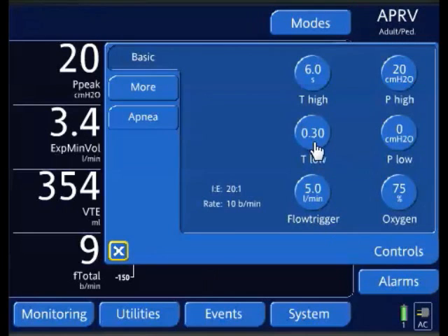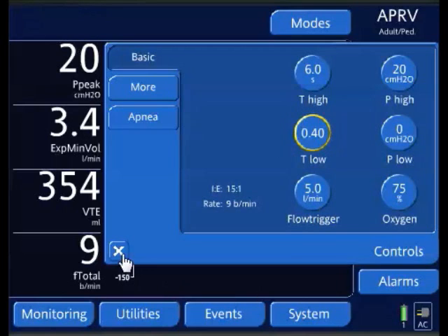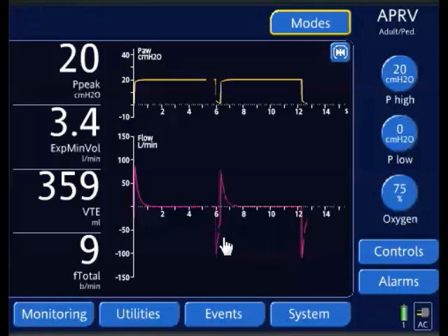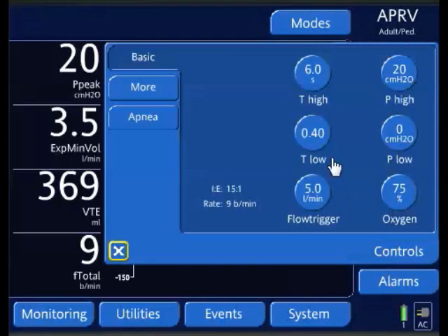I could additionally do it this way: I'll just lengthen the T-low out, starting to lengthen it and continuing to reevaluate my flow waveform. As you notice, I've made my setting changes — I'm going to wait for this breath. And as you notice, we're not to baseline yet, so I'm going to increase the T-low a little more.